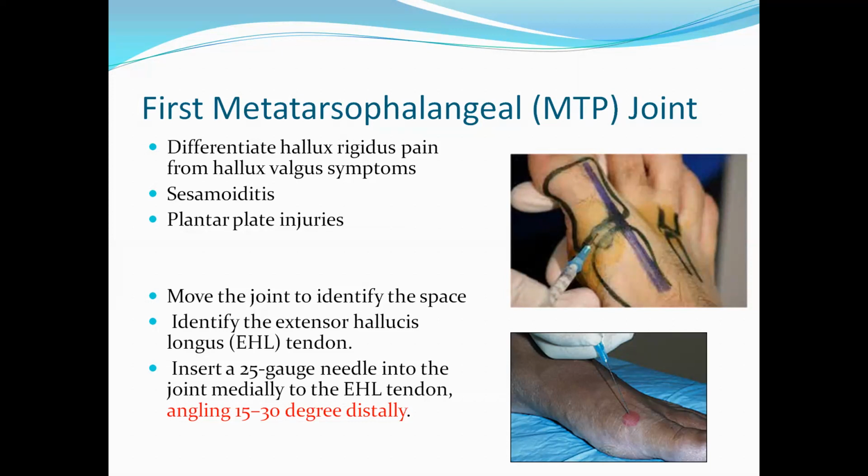You have a chronic pain around the first metatarsophalangeal joint. So here, it's a very superficial joint. There should not be any problem injecting into the joint. To move the joint, go for flexion and extension. Try to feel the movements at the metatarsophalangeal joint here. If not, then try to give a little bit of traction and go for flexion and extension. You can feel the joint space.